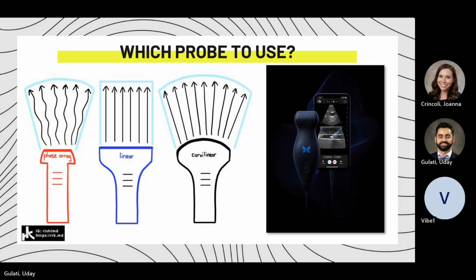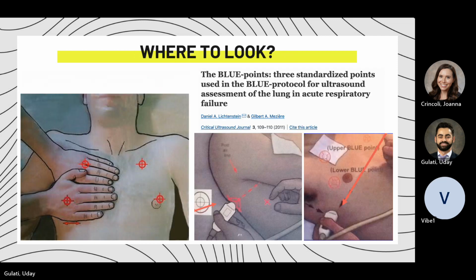So when you guys respond to a rapid response, a few of the residents and I used to take the butterflies that you guys have to every rapid response so we could ultrasound everyone and just get that practice in to make a diagnosis before the fellow would.